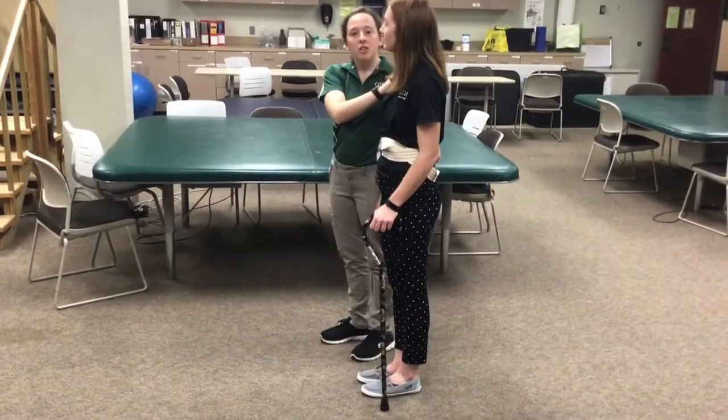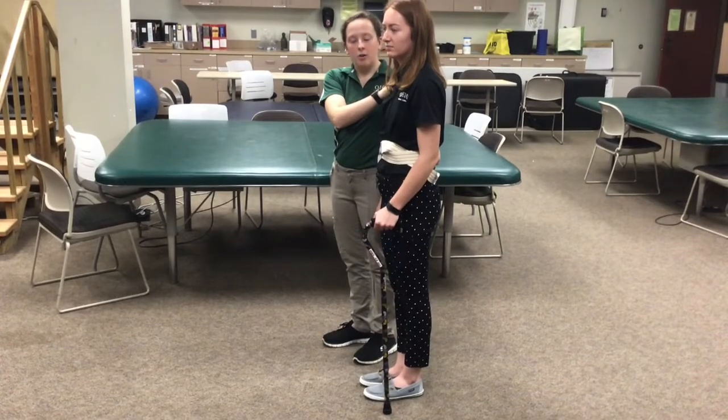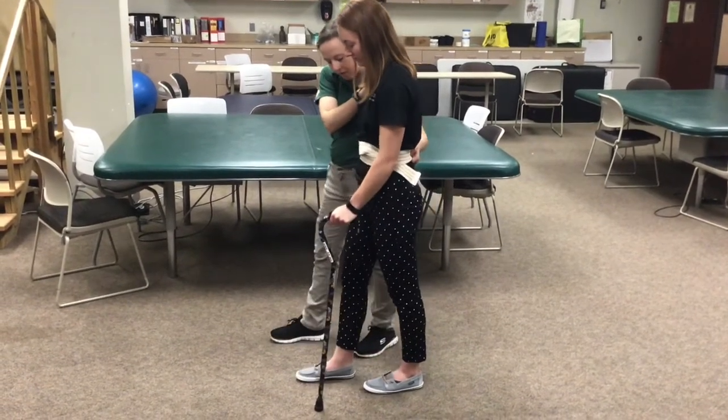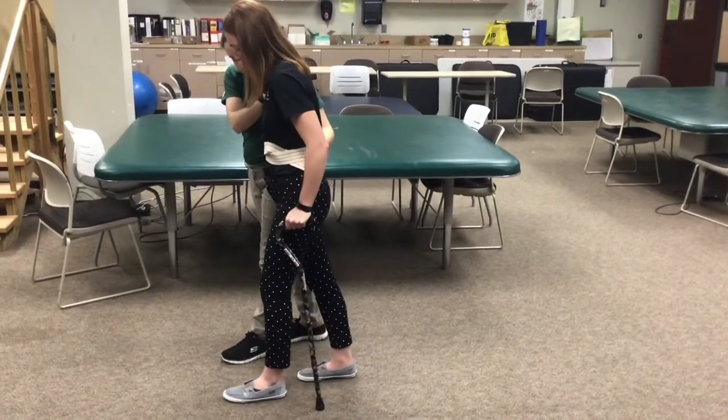With improved strength, your patient can utilize a step-through gait pattern. This is closer to a normal gait pattern. So first you'll move your cane forward one stride length, and then step with your involved extremity to meet the cane, and then with your uninvolved, you'll step past the cane. And then you'll continue that process.